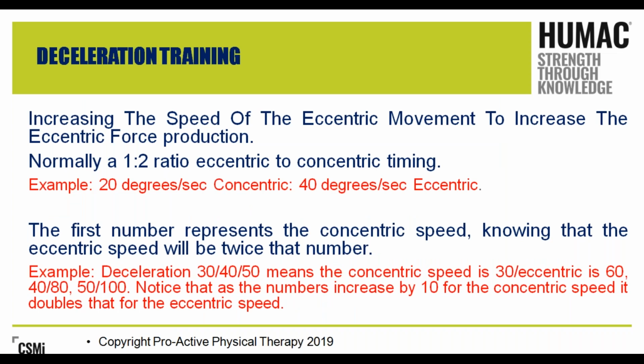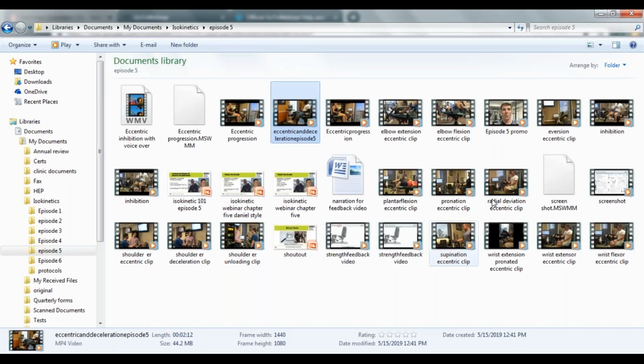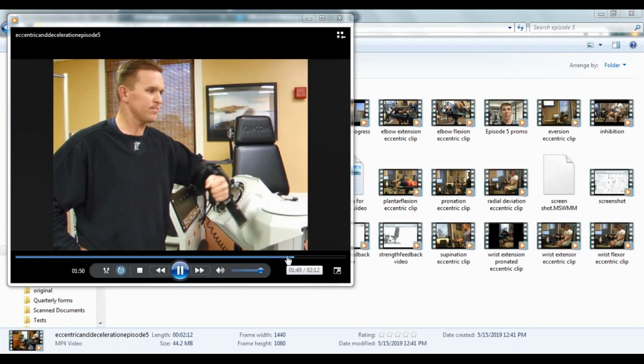So what's our progression that we're going to work them through? Well, we take them through a shoulder eccentric loading program. You heard about this during our mobility program. We take them up where they just ride through the range of motion, and we let them slowly follow the weight all the way back down so that they're comfortable. Once we have them doing that, so we know that they can load, we take them through a slow eccentric. Notice where his hand is positioned. He's following it up concentrically, and he's giving us a very gentle pressure upward during the eccentric mode of contraction for his posterior rotator cuff. And finally, when we have them significantly trained, and we're talking weeks into this program, we want to get into deceleration training so we can get them to that next level.